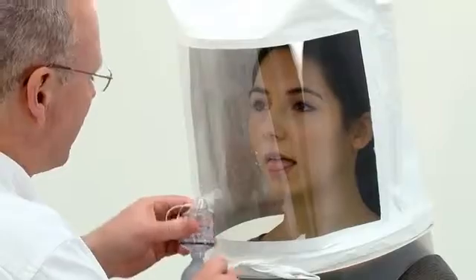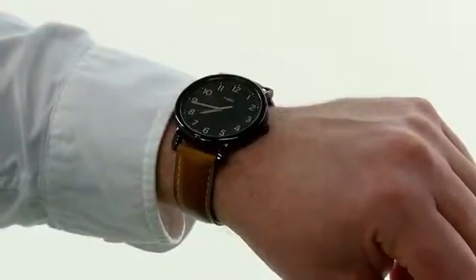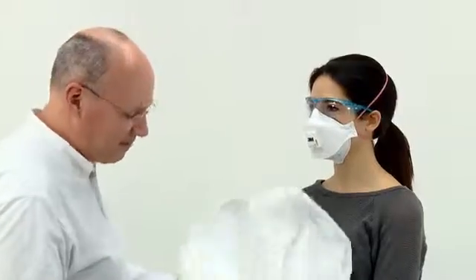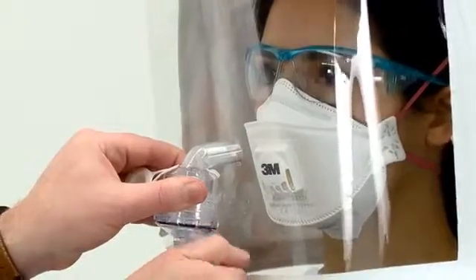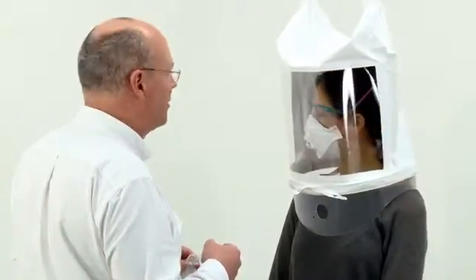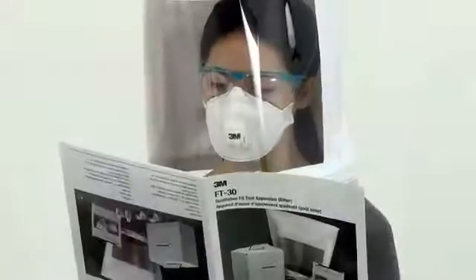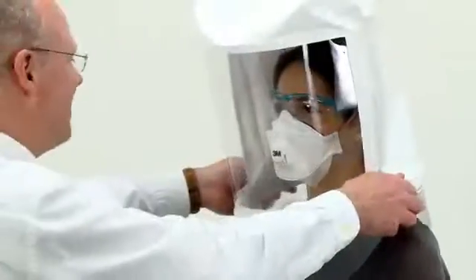If at any point during the test they indicate that they can taste the mist, stop the test and remove the hood. After allowing time for the taste to clear from their mouth, repeat the sensitivity test. Have them re-fit and adjust their respirator and repeat the fit test. Two failures where you are confident there are no obvious fitting errors may indicate that the model of respirator being tested is unsuitable for that person's face shape, and another size or model should be tried.